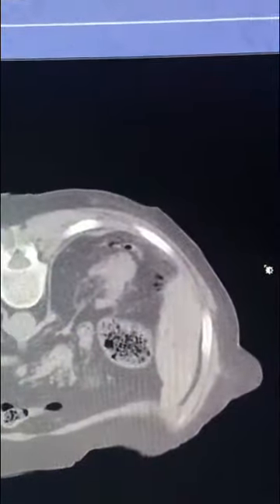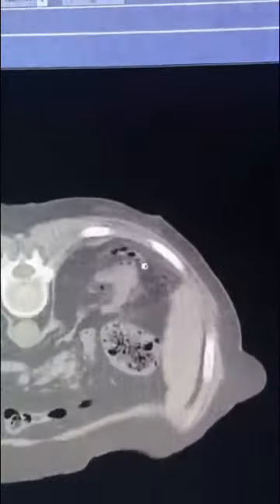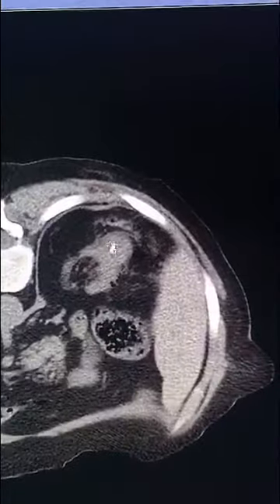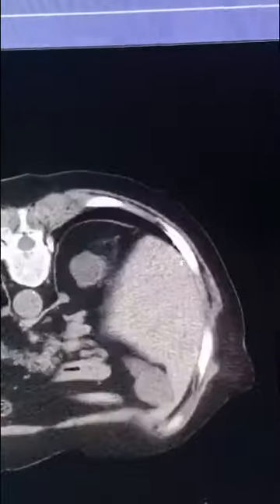We notice gas around the kidney, plus fat stranding indicating the ablation zone. The nearby organs are normal and there is no pneumothorax. Following this, the wound area was covered with a band-aid. The patient went back to the ward. She was given PRN medications for pain and vomiting, and she was discharged in less than 24 hours of the procedure.